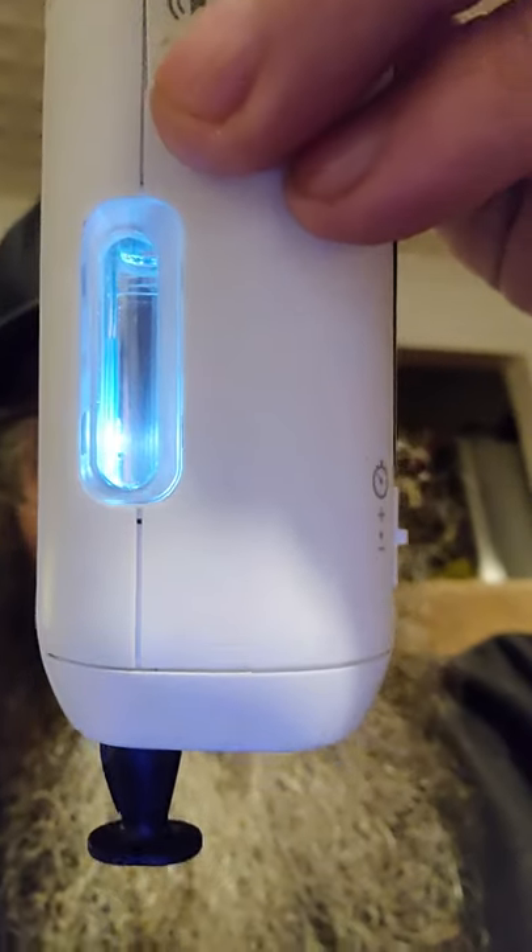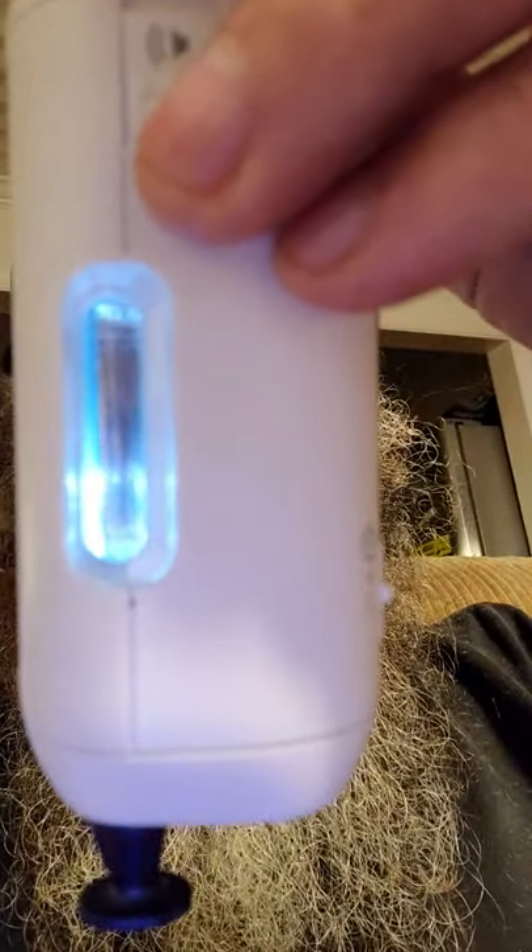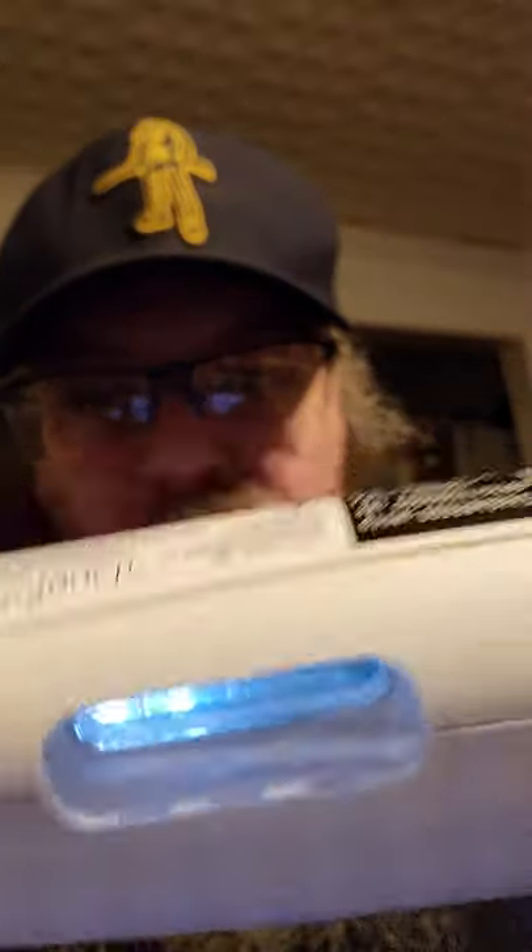Once the cartridge is in, that means it's ready to rock and roll, as soon as you pull your safety cap off. But first you want to check your window — it's a lighted window. You want it to be clear, not cloudy, and there should be an air bubble in it. That's a good sign.